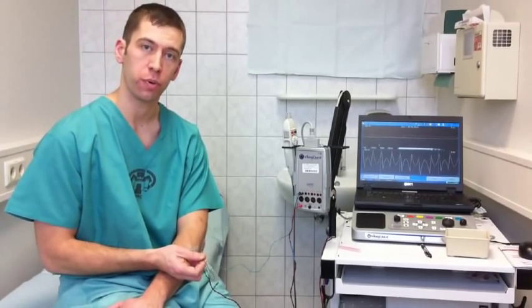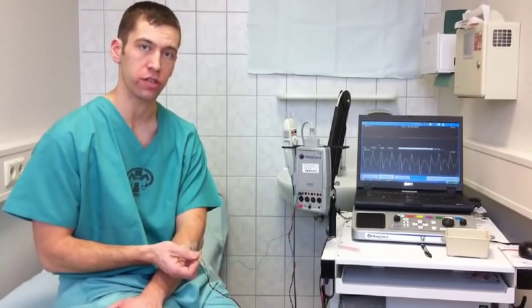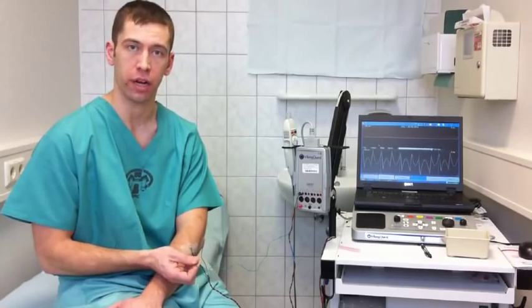The second part of the EMG test is the needle EMG examination. During this portion of the test, a small needle is inserted into your muscle and the impulses are analyzed.